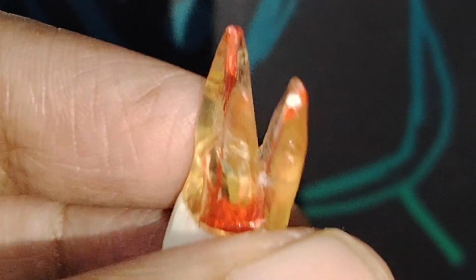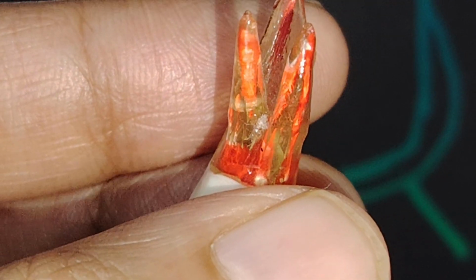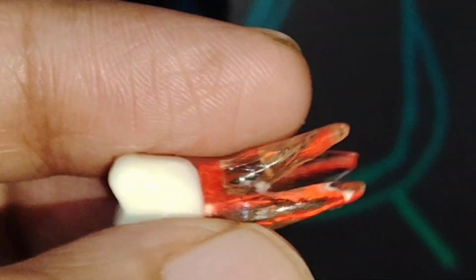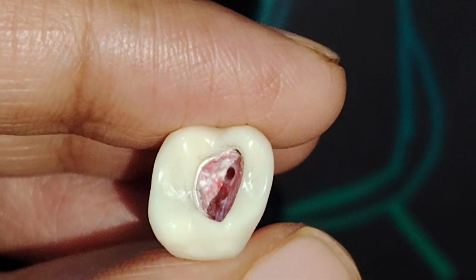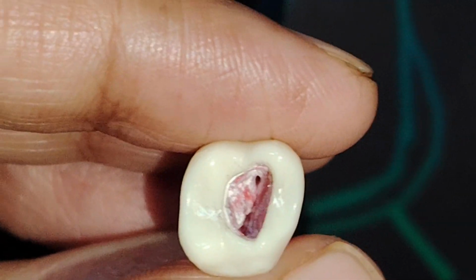You can understand these both are the mesiobuccal and distobuccal roots, and that's the palatal root. To locate, it is easier to locate the mesial and palatal because they are big in size.